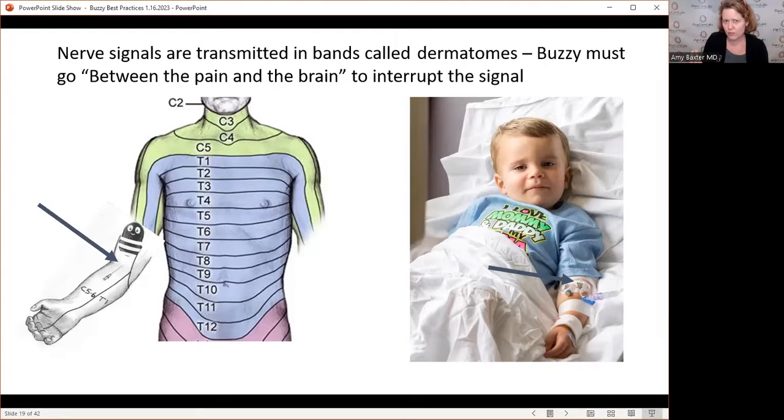It's pretty straightforward on arms, but when you start getting into port placement, areas where you're accessing a port, or you're putting in the clavicle, then it's actually good for patients to test, just because those dermatomes are not rigid and hard and fast, and each patient's going to be different. So the first time, use a toothpick or something like that to feel if you've got it in the right place where the dermatome is, just so you know.